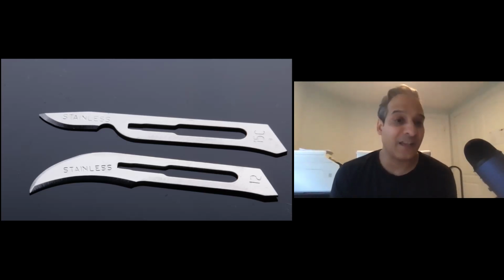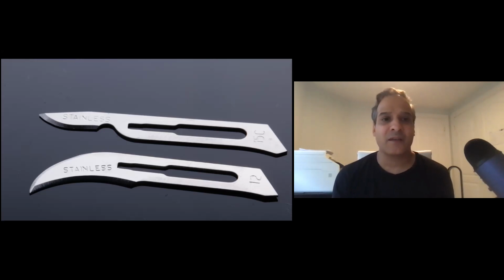As for gauges, if you're not good at suturing, don't start off with a 6-0. You're going to have a lot of problems. It requires a little more finesse and skill, but 5-0 would be something you want to start with. If you're going to start doing tissue grafts, make sure your suturing skills are up to par, because if you can't suture the site well, the whole thing will fail.